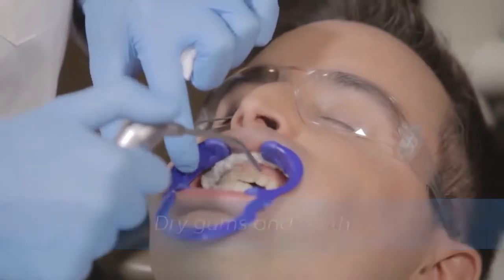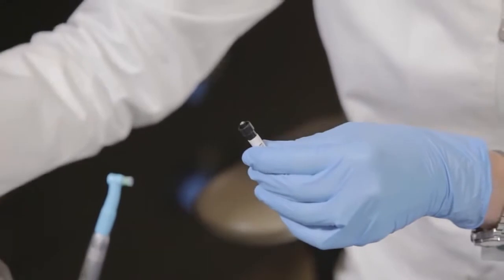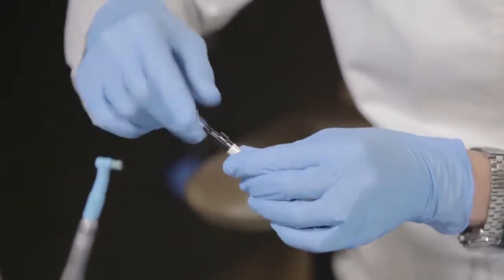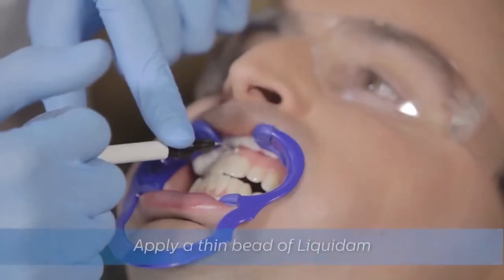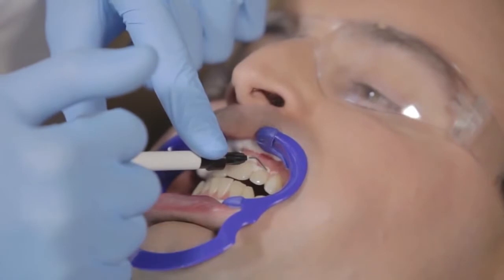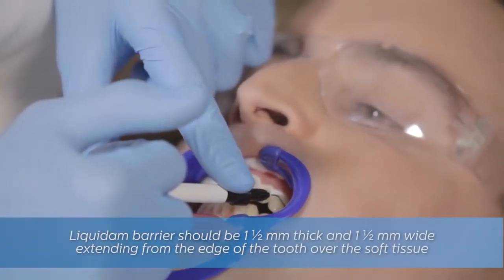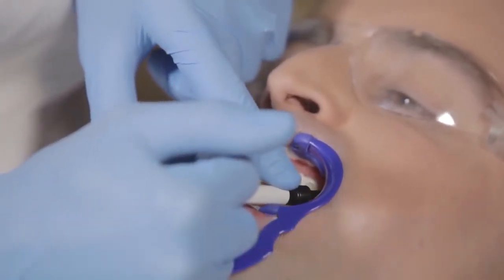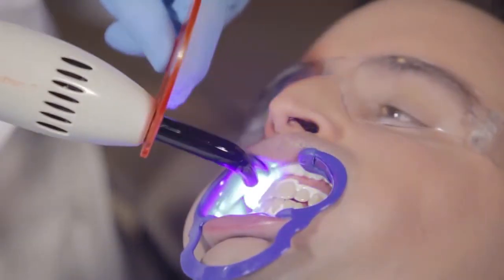Dry the gums and teeth. Next, twist off the cap on the Liquidam syringe and attach the metal tip. Apply a bead of Liquidam along the gingival margin, being careful to cover the exposed gum along the margin to help prevent any sensitivity. The Liquidam bead should be approximately one and a half millimeters thick and one and a half millimeters wide, drawn down to cover the papillas. When you are finished, cure the Liquidam for three to five seconds using a sweeping motion to prevent excessive heat against the soft tissue.